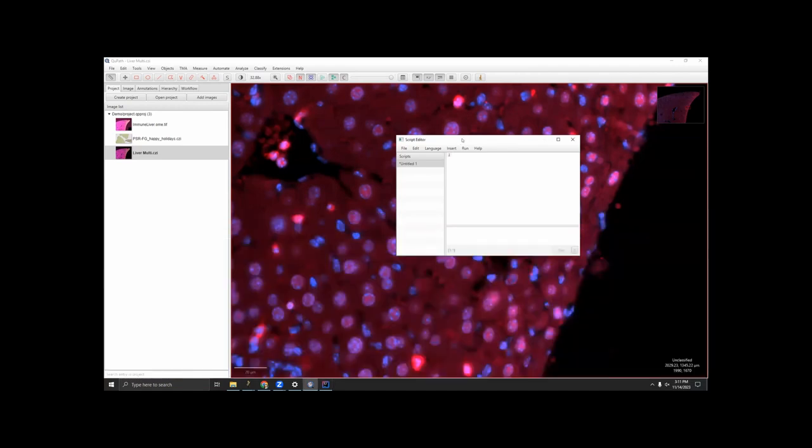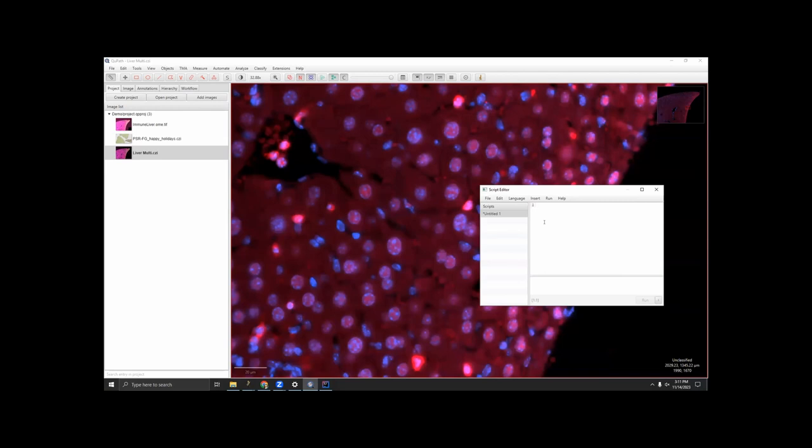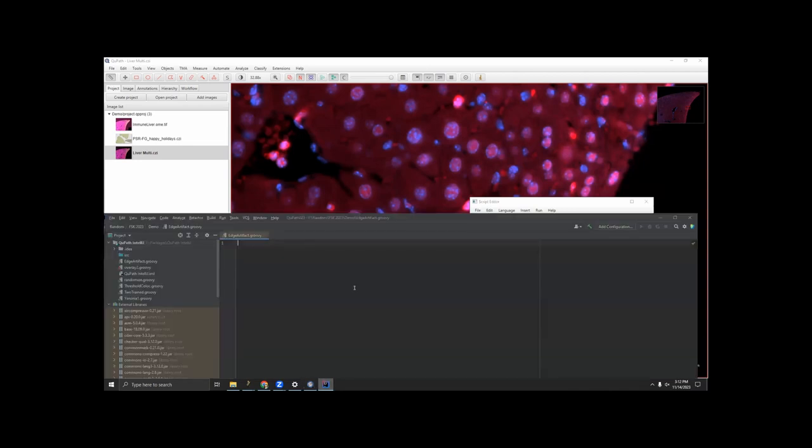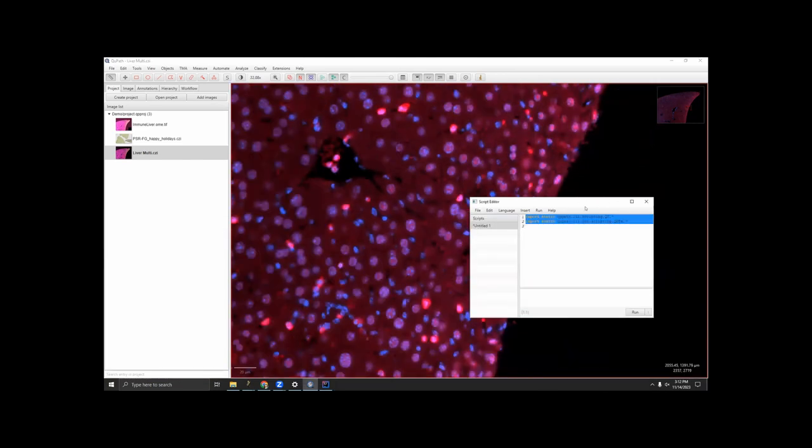And I always like to start with some standard import statements. And the easiest way to get them is actually through the QuPath script editor. So if you just go to insert imports QP and insert imports QPEX, this is the basic QuPath library and the extended QuPath library. And these two lines combined get you a lot of what you need for many things inside QuPath scripting. So I'm going to copy them and paste them right at the top of my edge artifacts.groovy script. Okay.